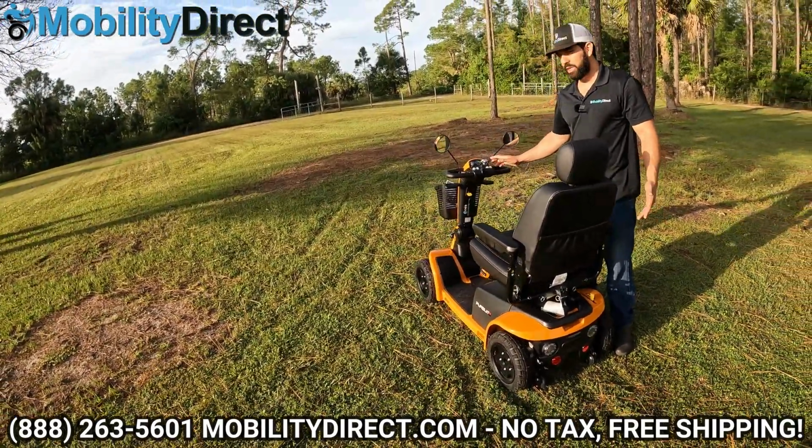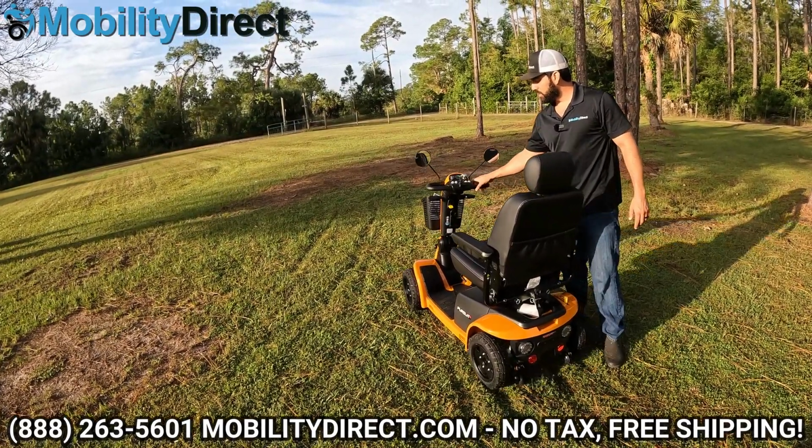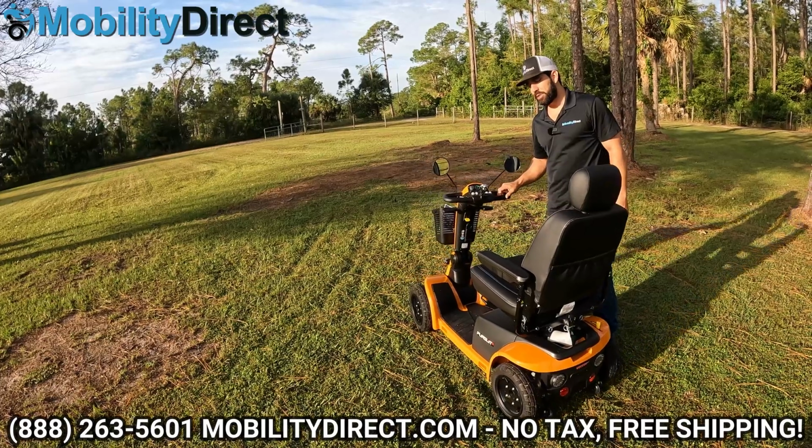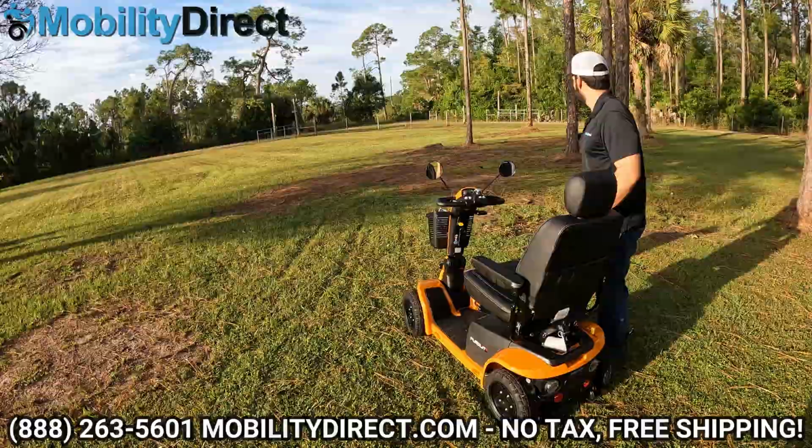Before, while it was flashing and the brakes were not on, if you give it throttle, it just won't move. So if you find yourself stuck and your scooter's not moving, that's probably what happened. Just make sure that lever's in the drive position.